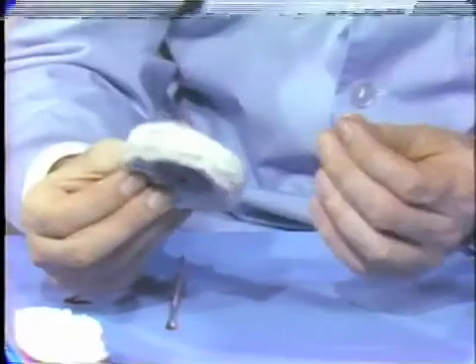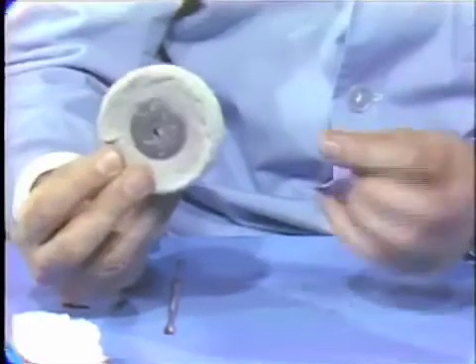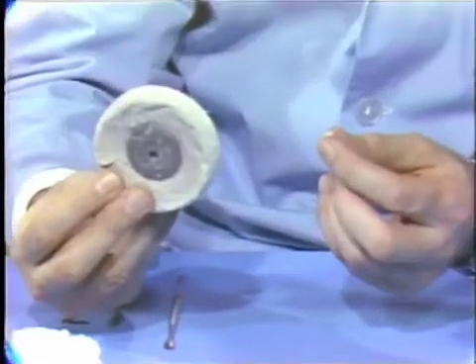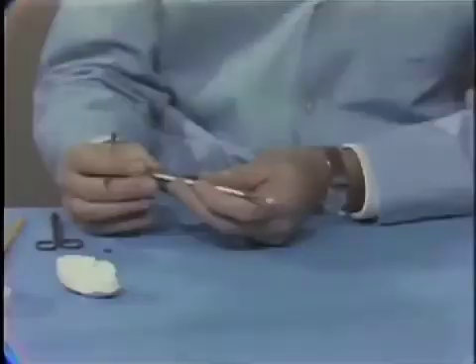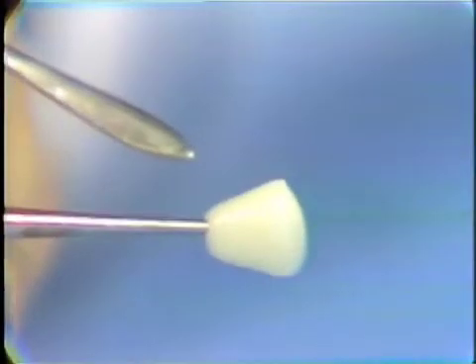Now we're not going to do this on camera, so we'll go away and polish it then with silex and with levigated alumina on one of these, and then bring it back and let you see the polished Pontic. The porcelain Pontic has now been polished with silex and with levigated alumina, and I think you can see the fitting surface there around there has now got quite a smooth finish to it without any marked facets on it.